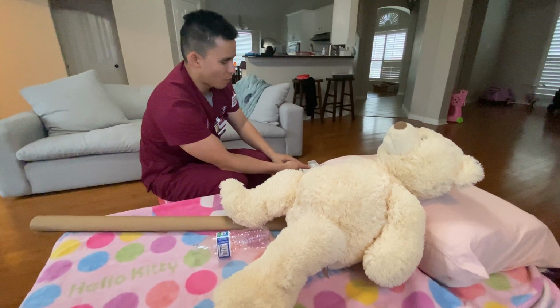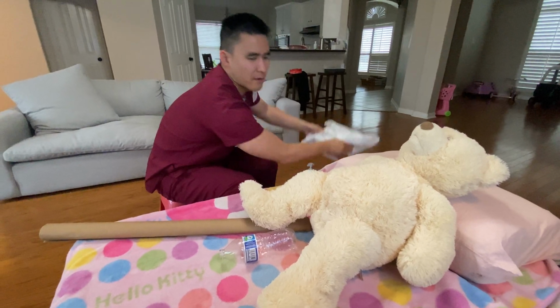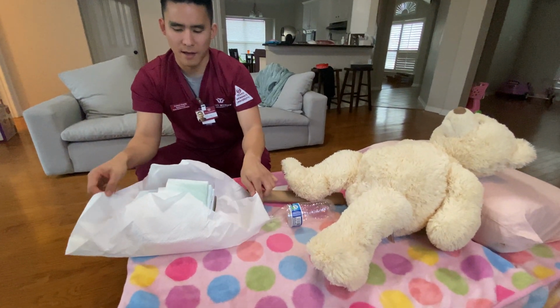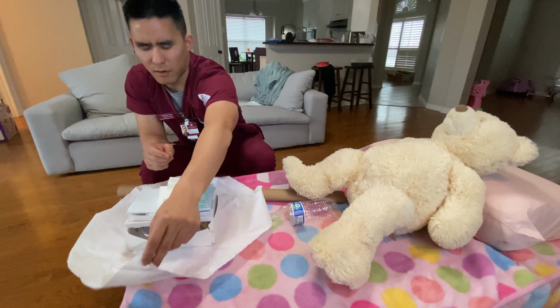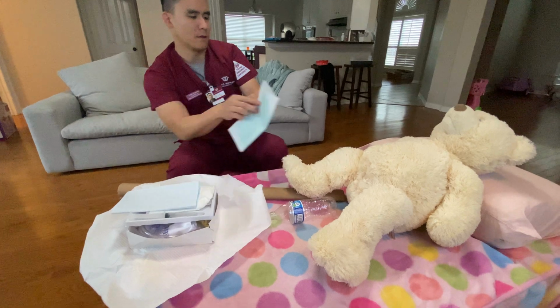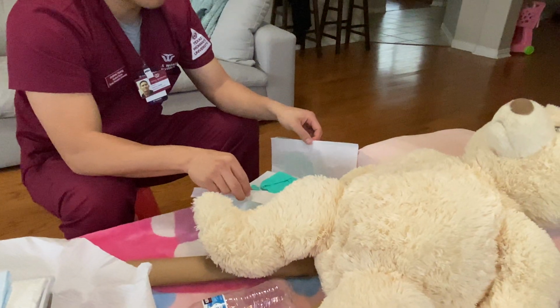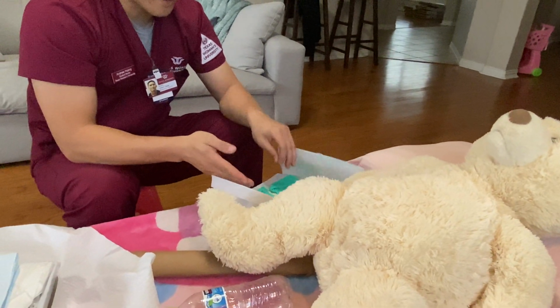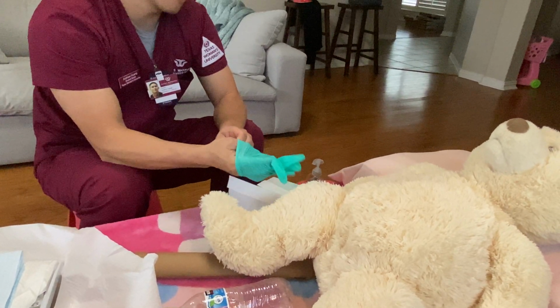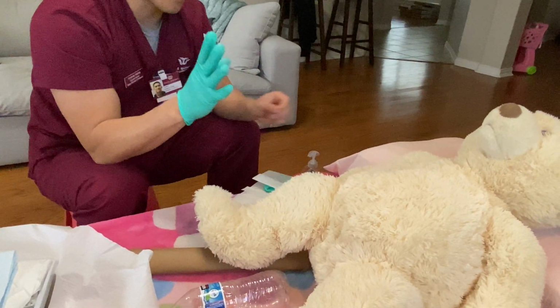So now I'll wash my hands again and get my sterile kit with the catheter. We're going to open the kit outwards, and then we're going to assume that the outer 1-inch border is not sterile. I'm going to grab the sterile gloves and place it. Now I'm going to open the sterile packaging outwards and use my left hand to grab the inside of this cuff and put the glove on my dominant hand. Okay, now my right hand is sterile.